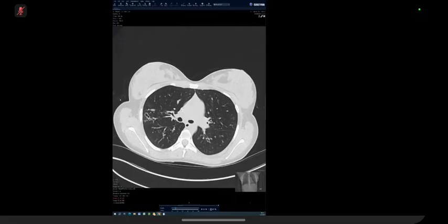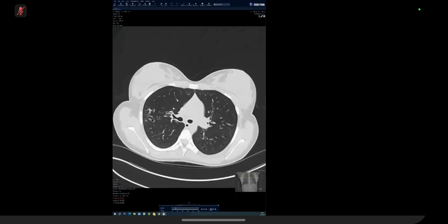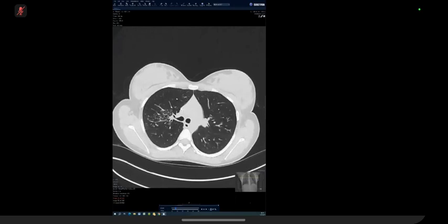What is endobronchial thickening? You mean bronchial wall thickening? Bronchial wall thickening, yes. Sorry. And you mentioned traction, bronchial dilatation, and bronchiectasis. Yes. So you have to pick one, I'm afraid. Yes, you're right. I think, sorry, there's cylindrical and cystic bronchiectasis. Yeah, exactly. Apologies. So when you say traction, you're implying ILD. The patient doesn't have ILD.